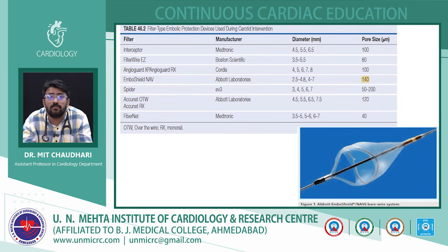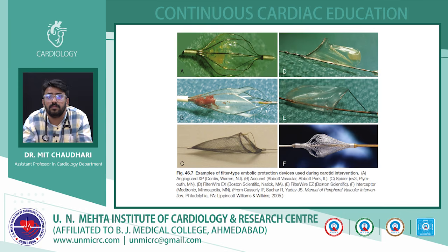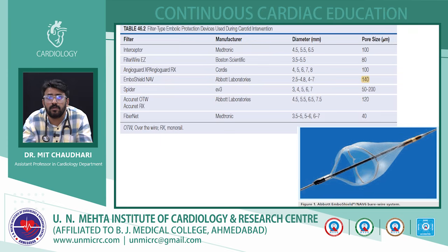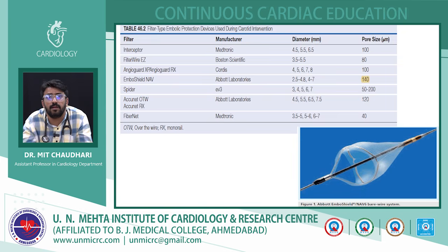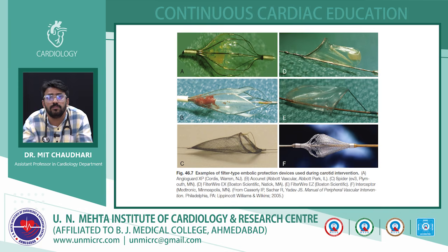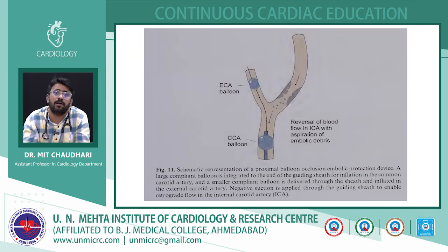This is how the EmboShield looks, which we use at our institute as well. The other filters look almost similar, but some aspects of the process of deploying them might be different, and one can see many videos on YouTube as well to look at how to use these filters, how to deploy them and how to prepare them.